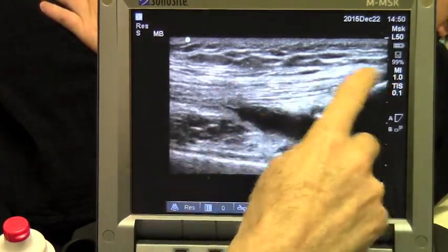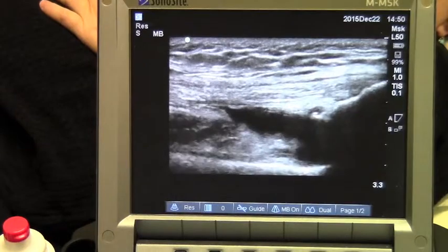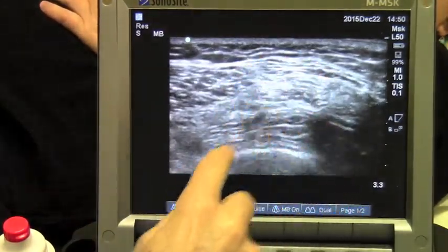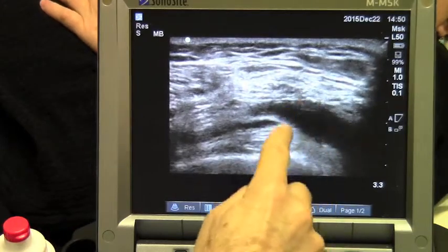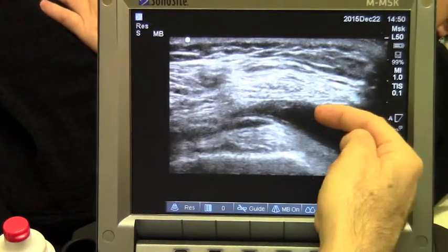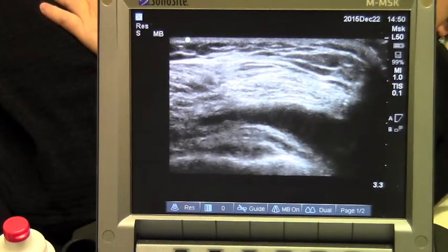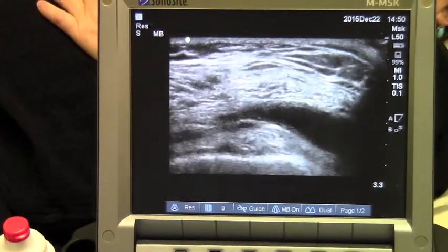This is the quadriceps tendon coming down attaching to the kneecap, called the patella, and this black area here is fluid. I can turn the ultrasound probe 90 degrees and see her quadriceps tendon again, and if I come closer to the kneecap I can see this fluid again. We can use ultrasound to guide our injections — using the needle to enter this little fluid collection, called the suprapatellar recess of the knee joint, and inject our PRP or prolotherapy solution right into the joint itself.